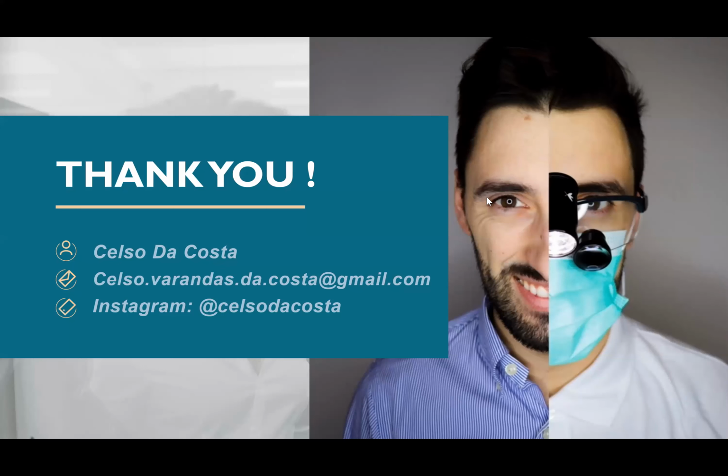And another question from Roxana: how often can we do the Clicks? If a patient is motivated and wants to repeat on a regular basis, what's your suggestion? Yeah. Normally, I say every 6 months. That's the best solution. In some cases, 2 or 3, we have done it 1 week apart because they wanted a little bit more whitening, but normally every 6 months.